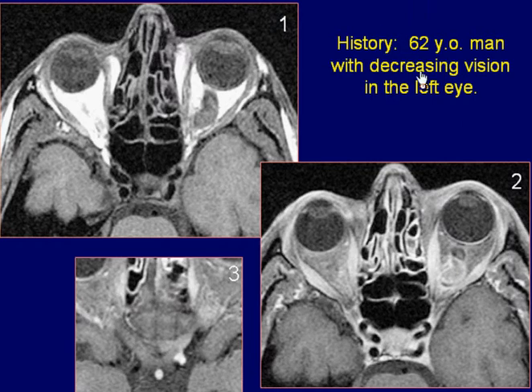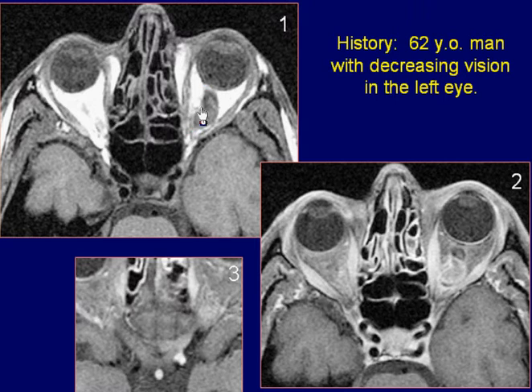A 62-year-old man with decreasing vision in the left eye. T1-weighted images of the orbit reveal an elongated mass lesion of intermediate signal intensity in the left optic nerve.